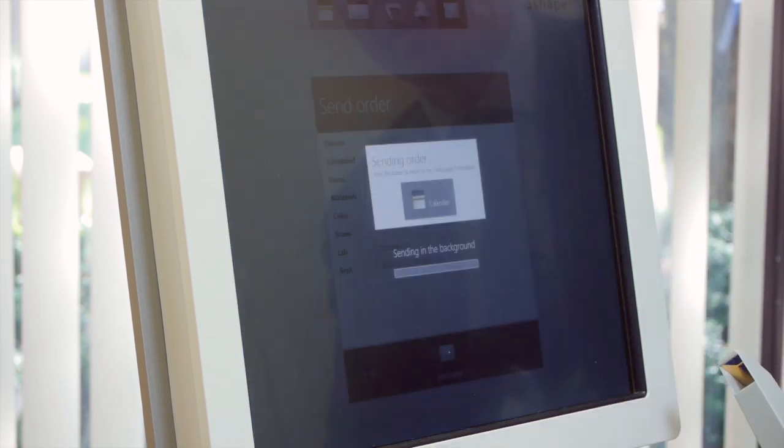You send the order and the lab would receive it within, I would say, two to three minutes, depending on the internet connection. So all in all, we are very proud of this product and we're looking forward to introducing it over here.